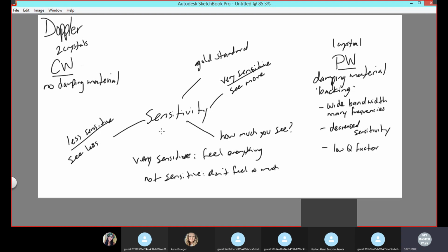When we get into gains specifically and scales, this will come up because your job is to figure out what is my problem right now. Am I seeing too much or am I seeing very little? It's always great to know where to start. If you know what the problem is, then it's easier to find a solution. If the problem is I am not seeing enough, the solution becomes, well, see more.